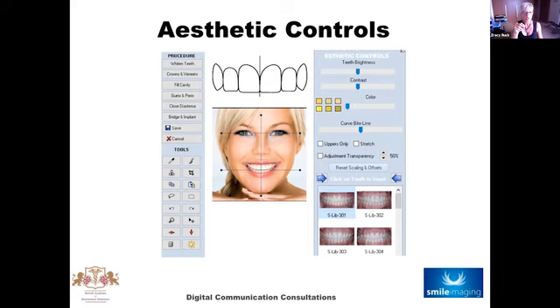So crowns and veneers would also do orthodontics. So there's always other tools, and so would bridge and implant also do orthodontics. So it's just knowing what treatment you want to show. So if it was a full orthodontic case, we would use crowns and veneers. If it was just one tooth that maybe needed to be rotated, we could either show bridge and implant or gums and perio for that, okay? And obviously we would teach you what to do with that.